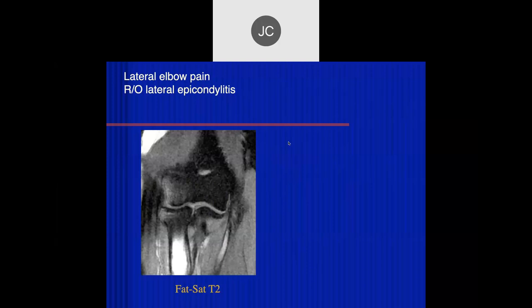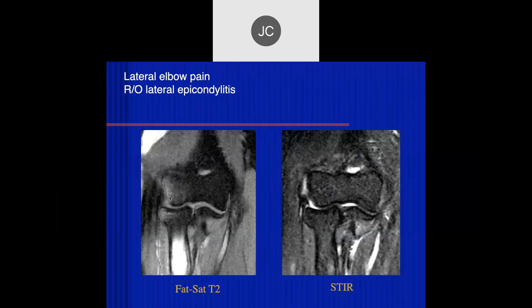On the lateral elbow I see edema in the lateral radial head and lateral epicondyle. Here's a fat-sat T2 sequence, and we decided we were concerned, so we got a STIR sequence. On the STIR you're not seeing the edema in those areas anymore.